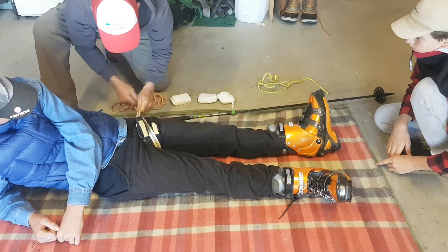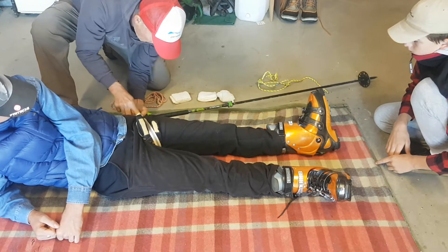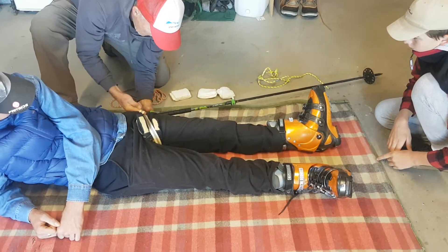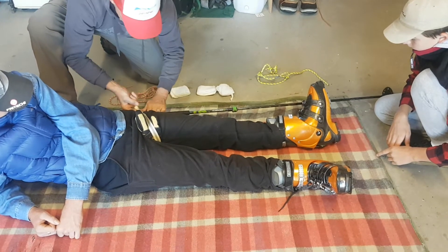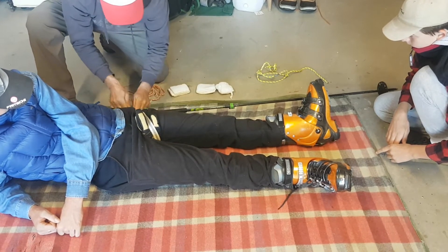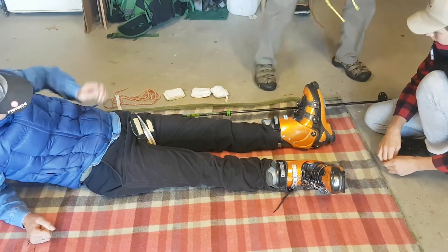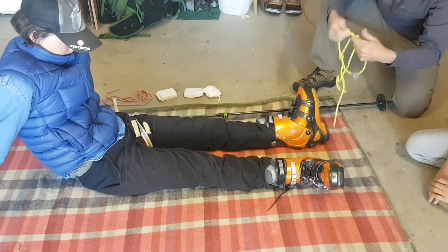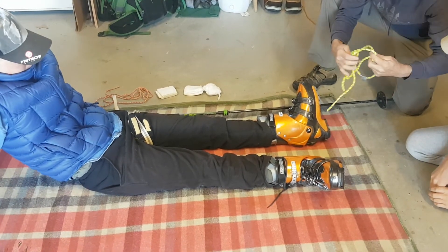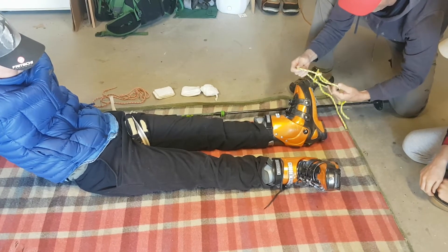We'll tie this off with another clove hitch. We'll put this on down at the feet before we put traction on, because once you put traction on you can't let go — that's very important. Being very gentle here.